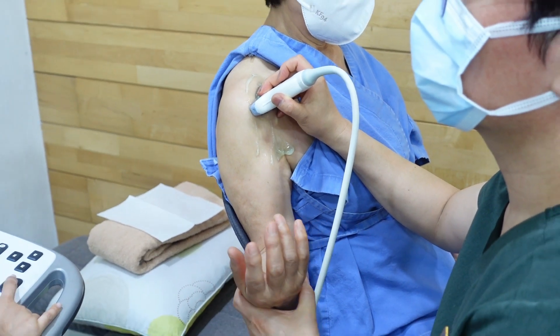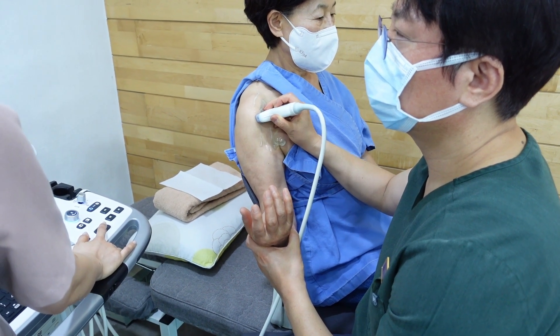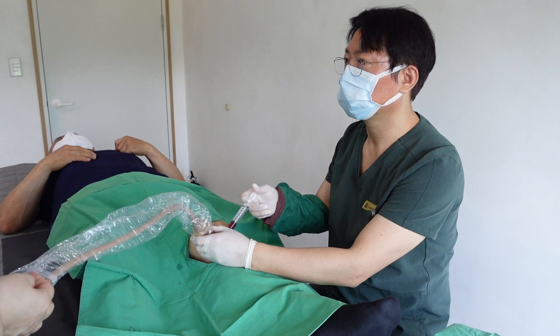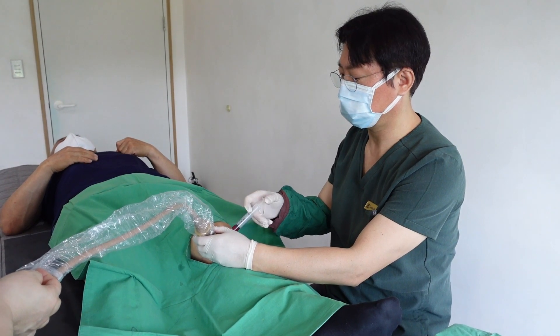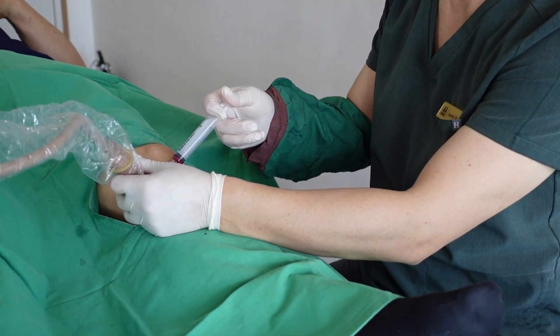Rest your middle, ring, and little fingers on the patient's skin to ensure stability and minimize any shaking or unwanted movements. It helps create a stable base and enables you to apply gentle pressure while scanning. Position your hands so that the hypothenar region, or your wrist, is in contact with the patient's body, creating a stable pivot point and helping minimize unwanted movements or shaking while scanning.